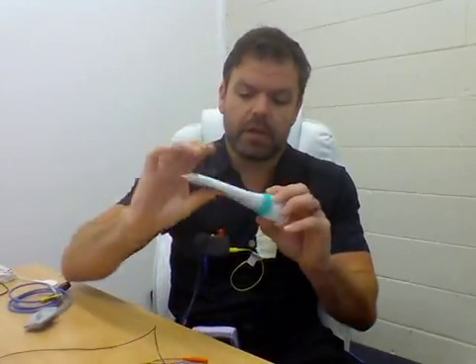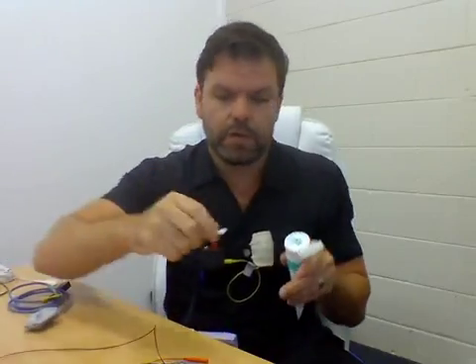So before we stick each sticker on, we do what we call skin prepping, which is basically a fancy word for cleaning the skin, and to do that we use some Nuprep. It's basically an exfoliant paste, like a gritty type paste, and you just grab a little cotton bud that we supply for you and squeeze a bit onto the cotton bud, and wherever you're going to put one of the stickers, you will clean that area, give it a good clean, and then just wipe it dry with a tissue or some paper towel or whatever you like. You can just wipe it with your hand if you want. Make sure it's nice and dry, and then you'll peel off the sticker and you'll put it on the different areas once they're clean. So that brings us to the next step, which is the electrode placement.